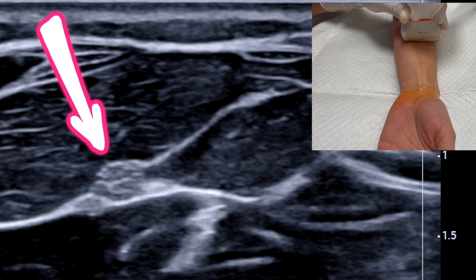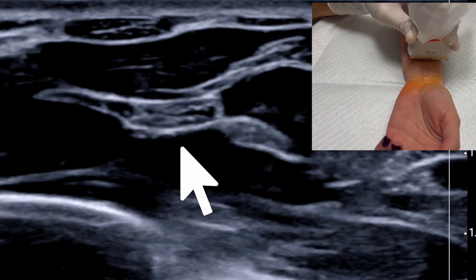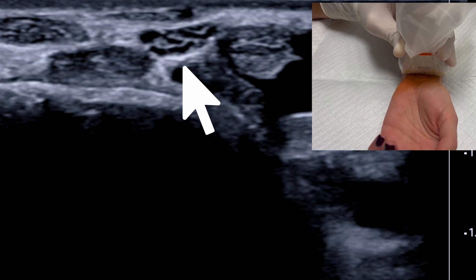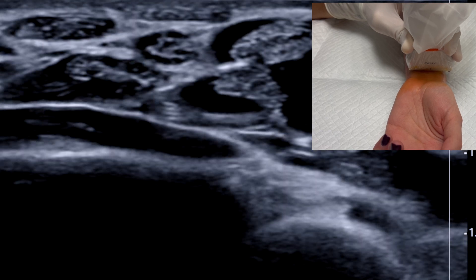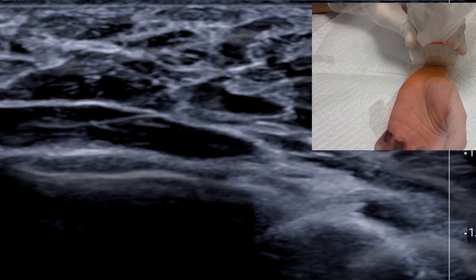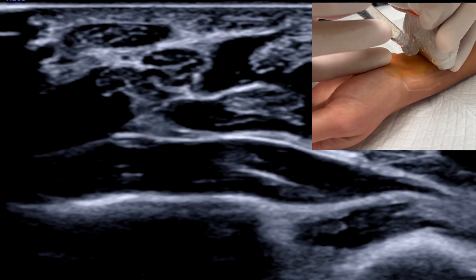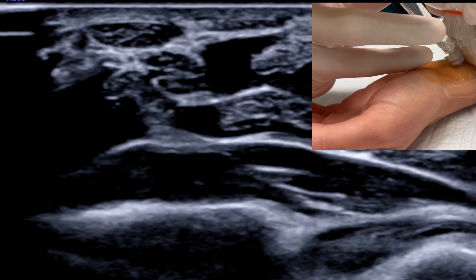Starting with the hand supinated on a flat surface, the median nerve is easily visualized halfway up the forearm as a piece of popcorn or honeycomb in the fascial plane between the deep and superficial flexors. Using a high-frequency linear probe, trace the nerve down toward the wrist, where it becomes much more superficial. Note that in the carpal tunnel there are a handful of tendons that look just like the median nerve, which is why we trace it down from the forearm to avoid confusion.